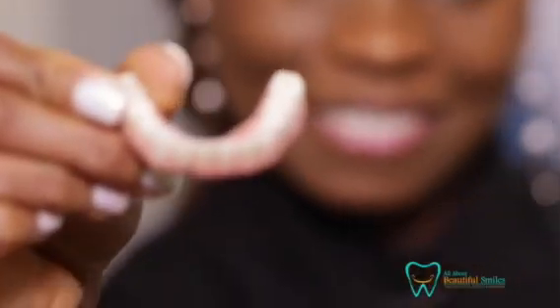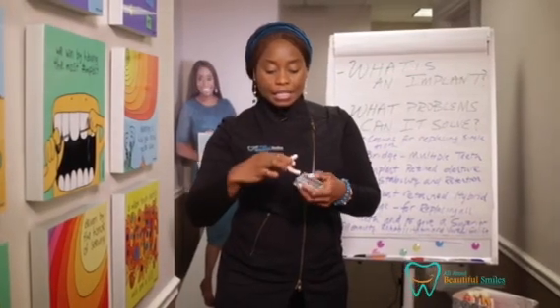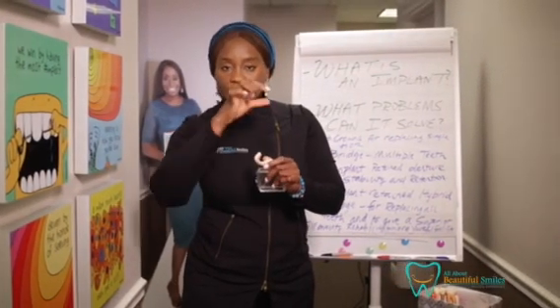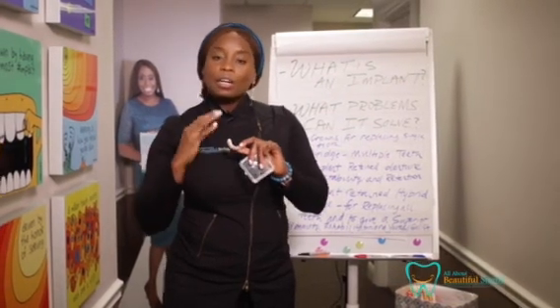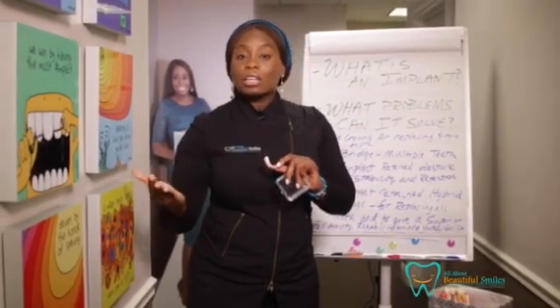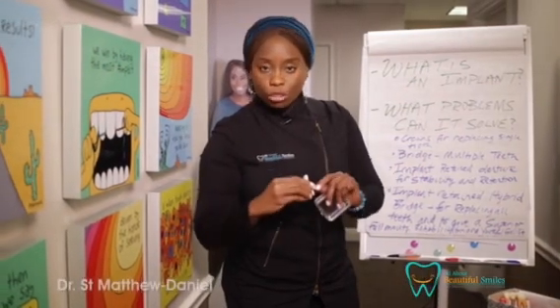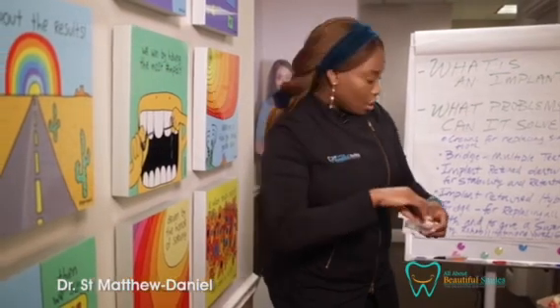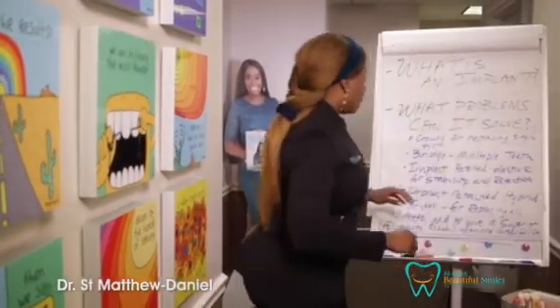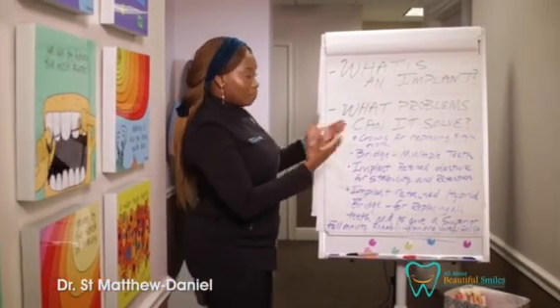This is the most premium level of implant dentistry, and it's essentially just a bridge. It just sits on your ridge. We screw it on. The only time you can have it off is when you come in for your regular hygiene cleanings, and we screw it right back on, and you can't take it in and out at home. So there you have it. The different kinds of implant restorations and the problems they solve.